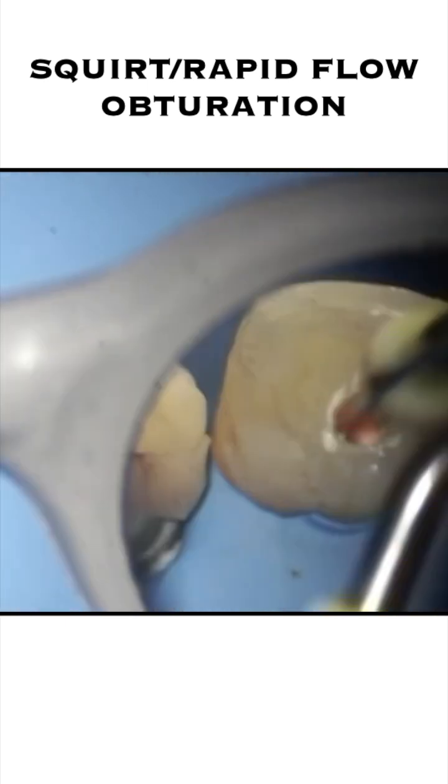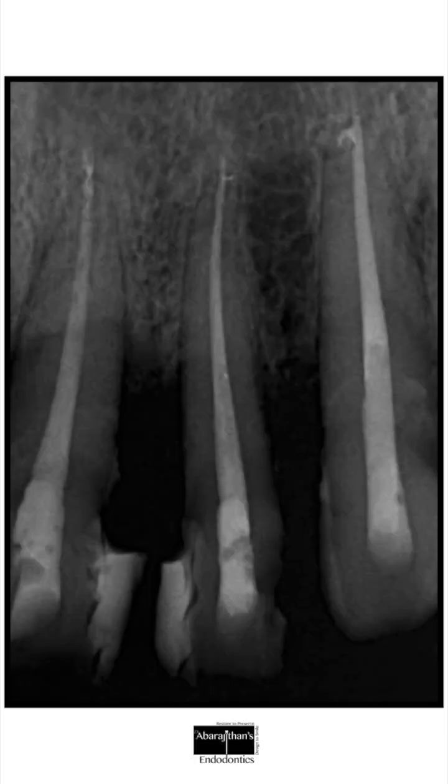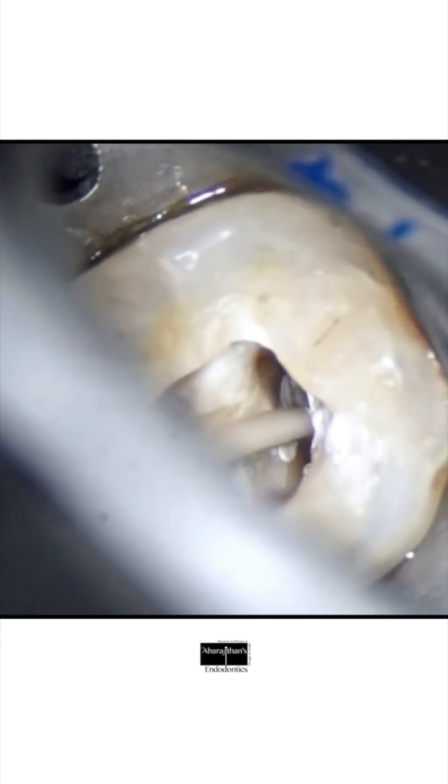One of the advantages of this technique is that it fills apical ramifications especially well. Whenever we have blocks, apical ramifications, or ledges that cannot be bypassed, we use this technique. It can be done with any sealer — you can see here I'm using a bioceramic sealer — and the steps are the same: inject the GP and start packing the apical third first.